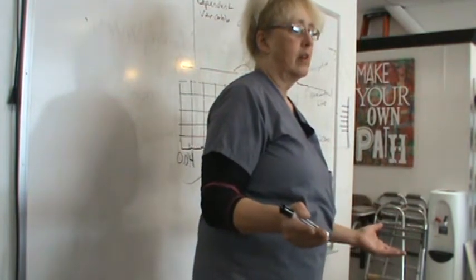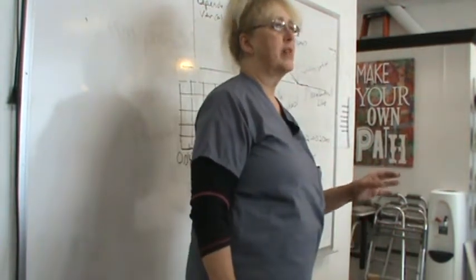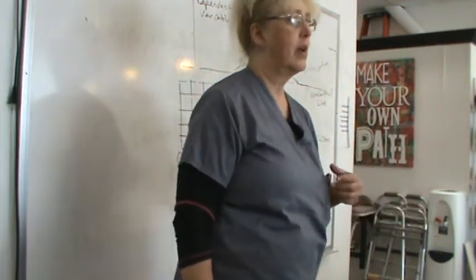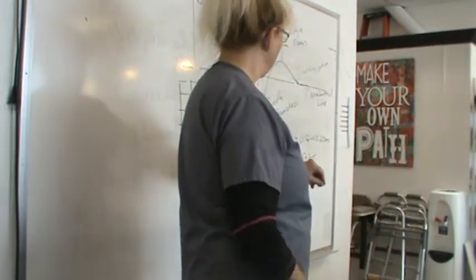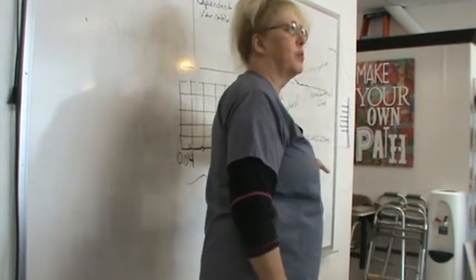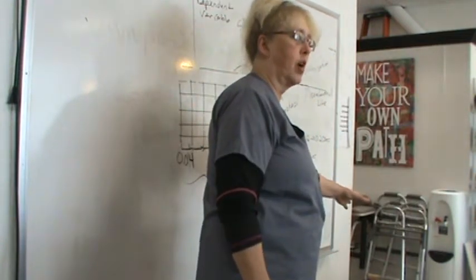Good? So what we're going to look at in the next few minutes is rhythms, and I'm going to explain to you why these rhythms are normal or abnormal. Look at this. If you measured your PR and it's between 0.12 and 0.20, you measured your QRS, it's between 0.08 and 0.12, and you measured your QT between 0.34 and 0.44.